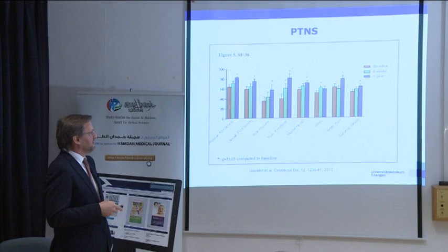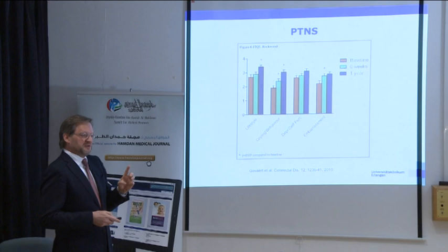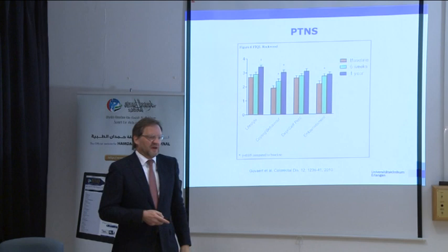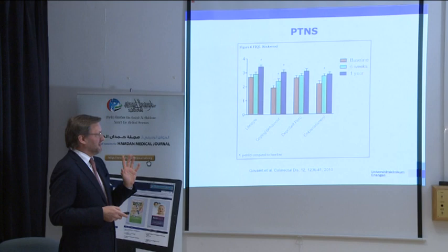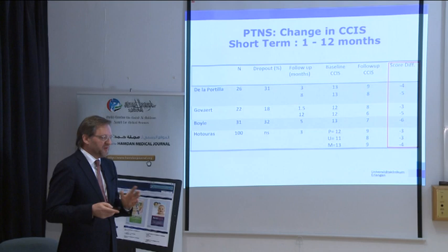This results in improvement of quality of life, even measured with the SF-36, but more prominent if the disease-specific Rockwood scale, the ASCRS scale, is used, a clear improvement during the course of treatment, and even after the treatment has been discontinued, after 1 year follow-up. So there seems to be a form of neuromodulation effect, of neuroplasticity, going on with this peripheral nerve stimulation. These data are pretty preliminary, but they are reproducible, and thus there will be a major focus on that in the years to come.